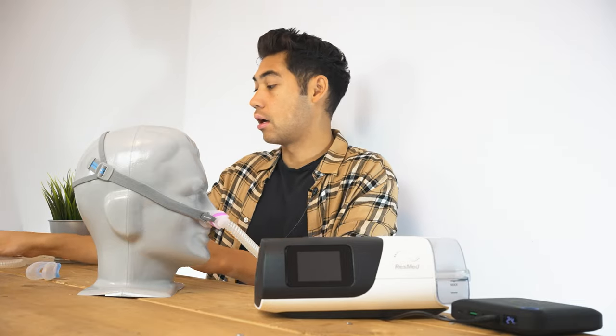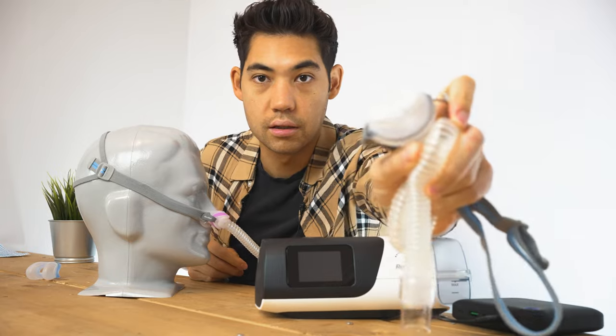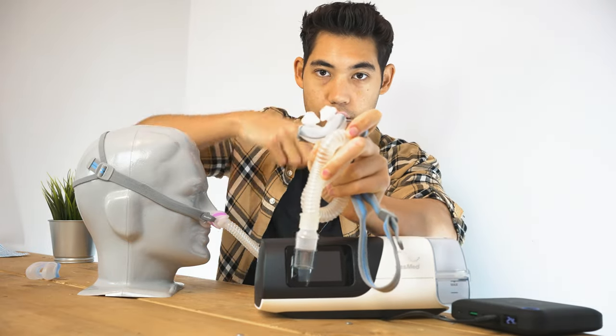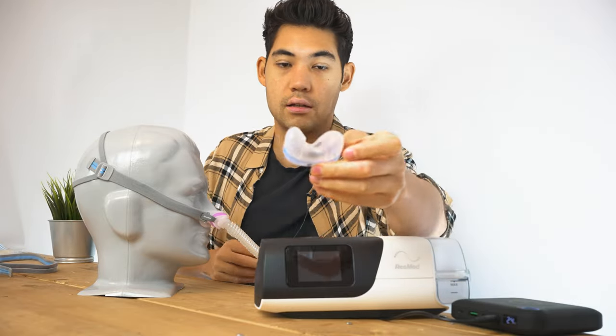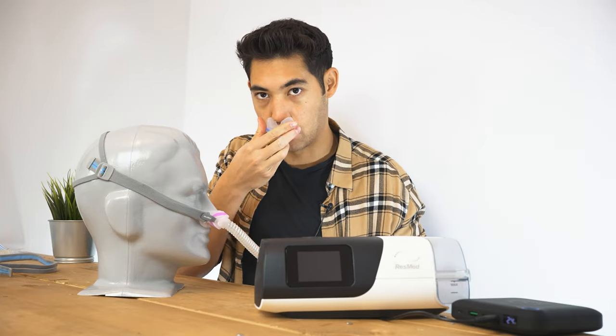So what is the difference? A pillow mask looks like this — this is the front of it — and it has these two pillows here. Whereas the cradle mask looks like this: nothing sticks into your nose, and it just goes right under your nose.